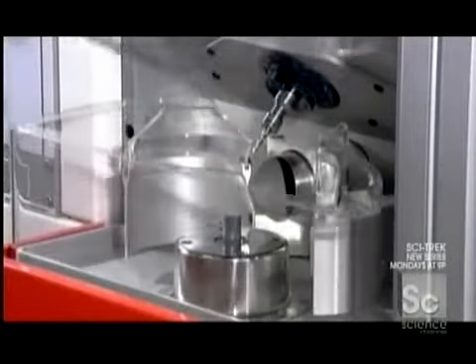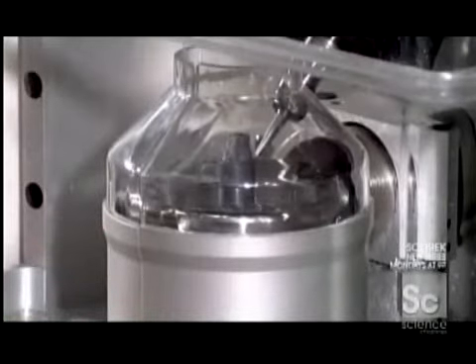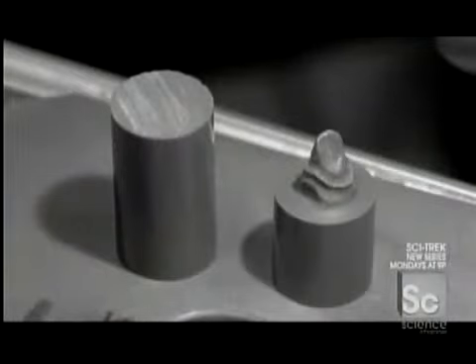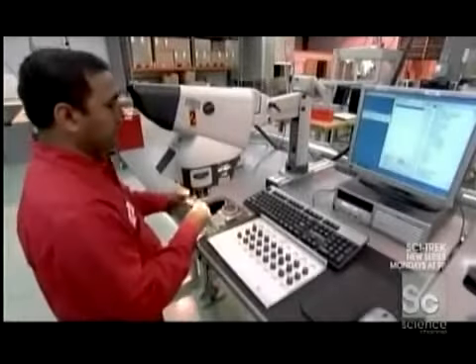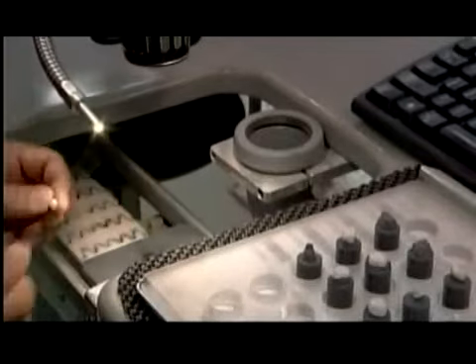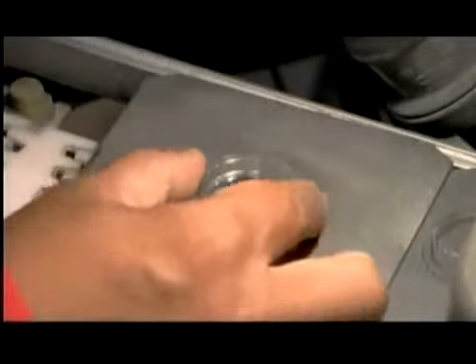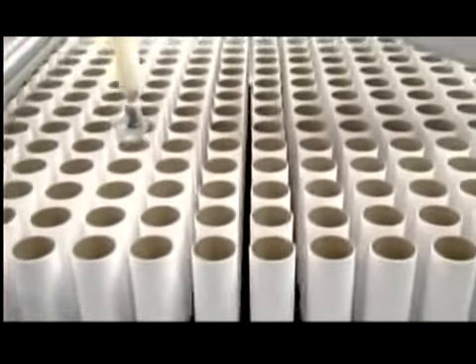They carve a plastic copy of the tooth using the same data scanned into the computer earlier. They use this plastic replica to test the fit of the ceramic one. A technician inspects the ceramic for chips or cracks, then packages it for shipping. This tooth-like shell is now on its way to the laboratory, where it will get the finishing touches that will transform it into a crown.